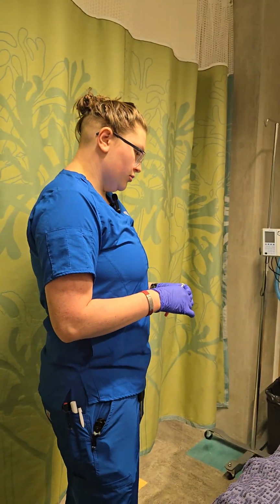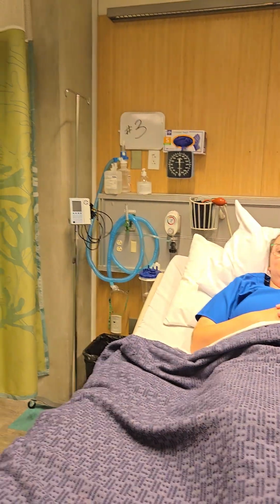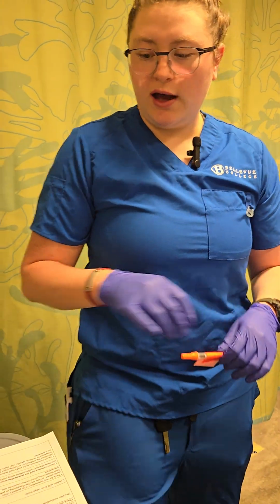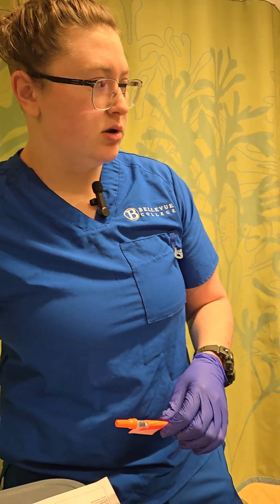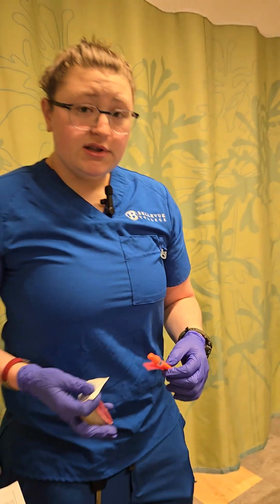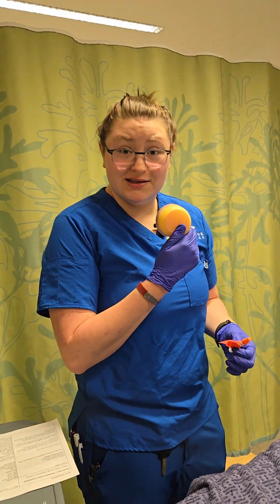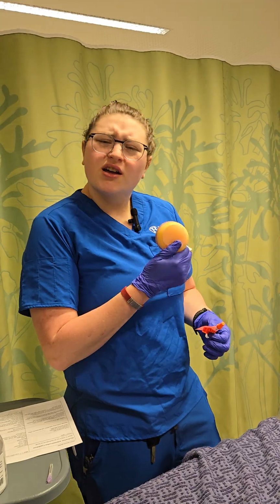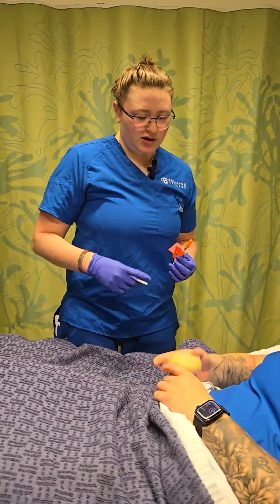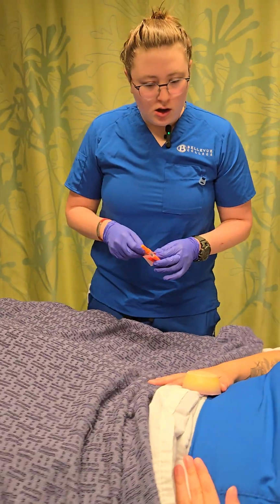I'm now going to scan the wristband and scan the medication. Excellent. Do you have a preferred site to use? Your abdomen? Great. For video purposes, since we're obviously not going to actually be injecting students, we have these cupcake-looking devices that we're going to be injecting into. Put that on your abdomen. Where was the last place you received a dose? My abdomen on the left side. On the other side. Got it.